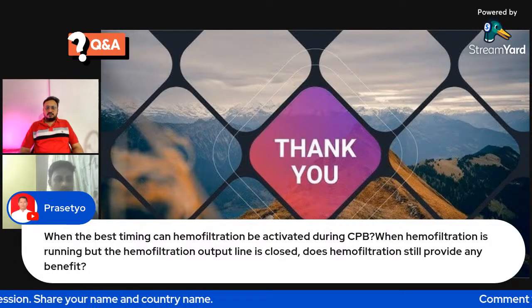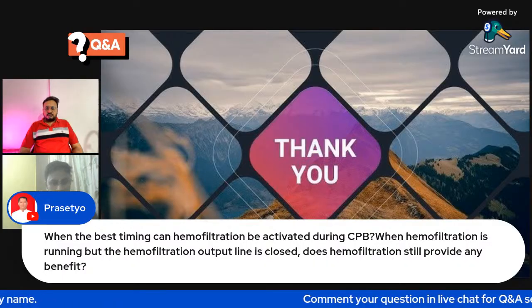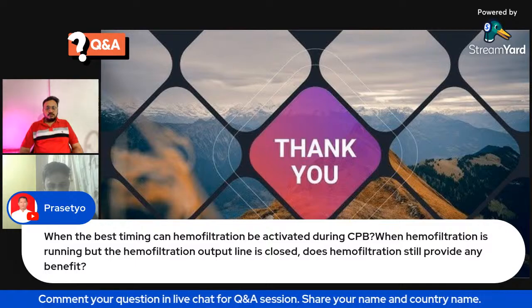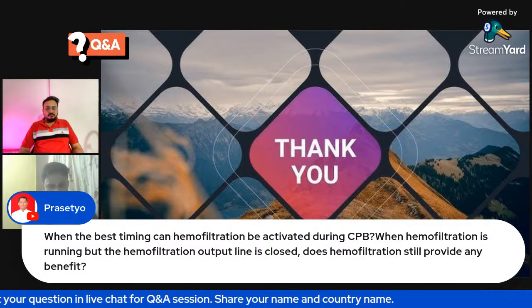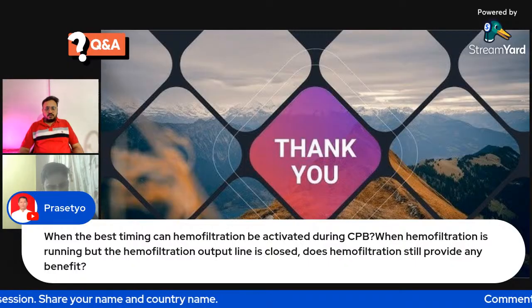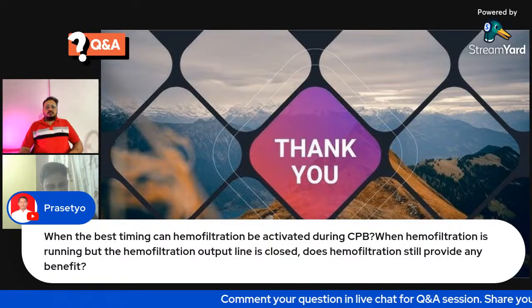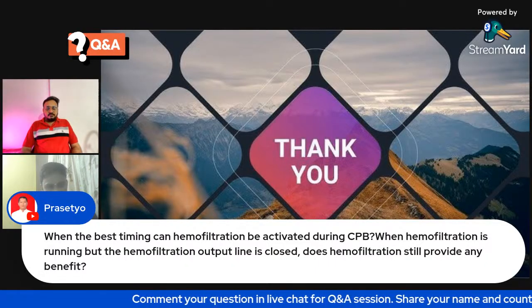If potassium is high, ZBUF is useful. So when hemofiltration is running but the hemofiltration output line is closed, does hemofiltration still provide any benefit? During hemofiltration, when the output line from the filter is closed, does it provide any benefit?